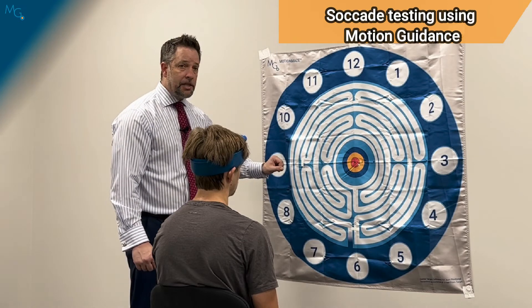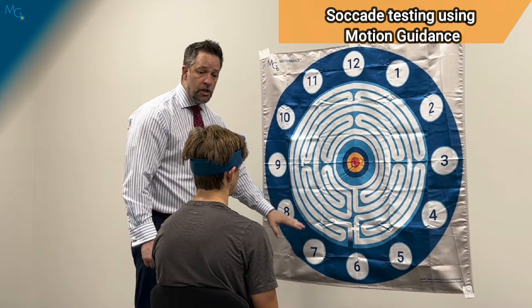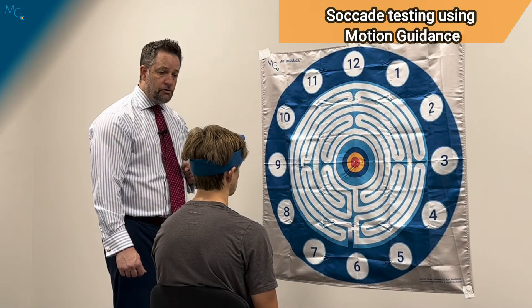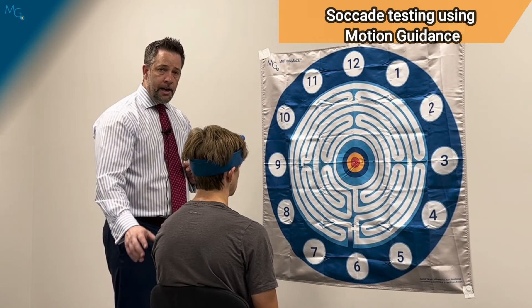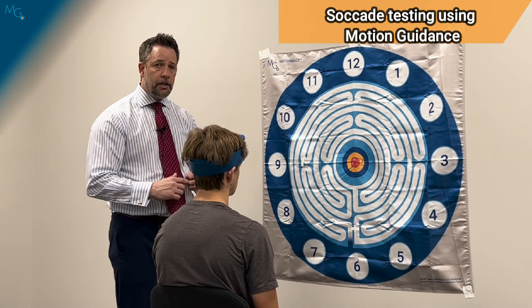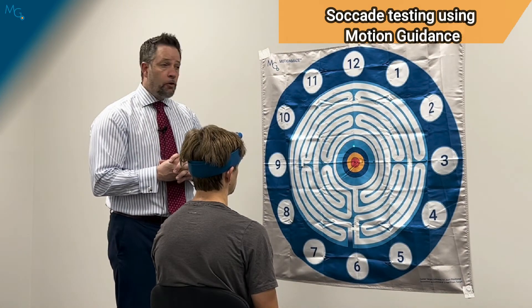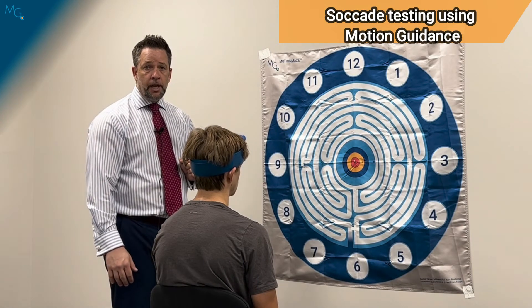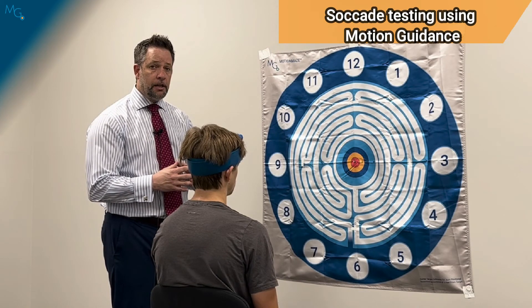We would do the same test for vertical saccade. I'm going to have the patient look just below the 12 and just over the six while not moving their head — go ahead and look up and down 10 times as fast as you can, not stopping in the middle. I would then record headache, dizziness, nausea, and fogginess, and review the video to see if the patient was moving or drifting in a particular direction. This helps me dictate how specific the home exercise program needs to be and what education I can give the patient.